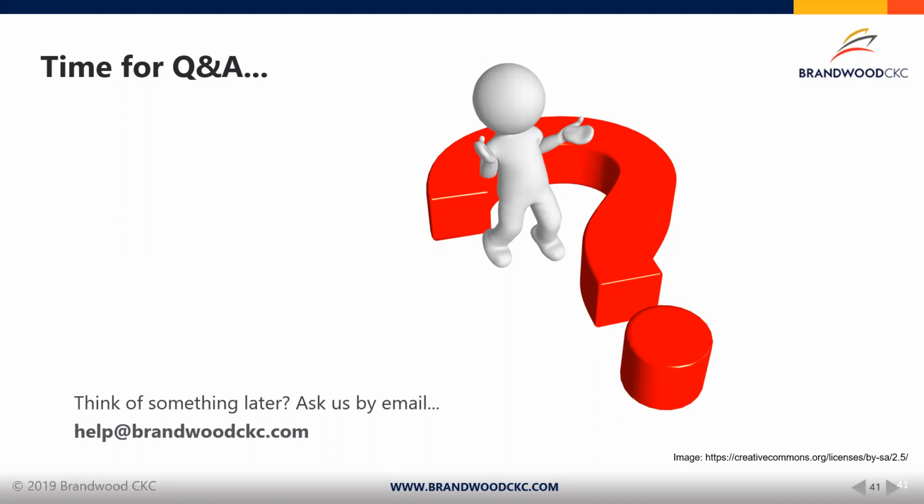So the crucial thing here is to understand and ensure you have total coverage of your validation activities. I understand that Agile includes user stories which are fed in by your design inputs, and you may have system or high-level design inputs, and you can go through the Agile process, and at the output of the software build, you can do a validation or verification exercise to test the overall software. So those are typical approaches used.